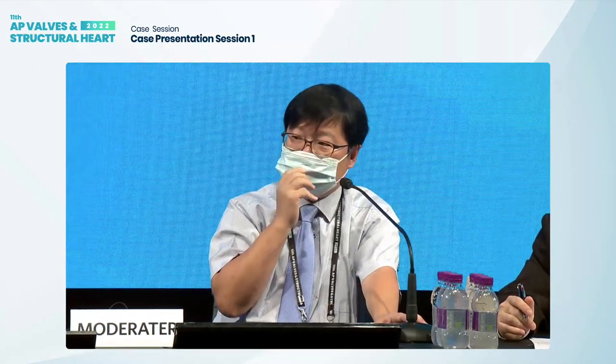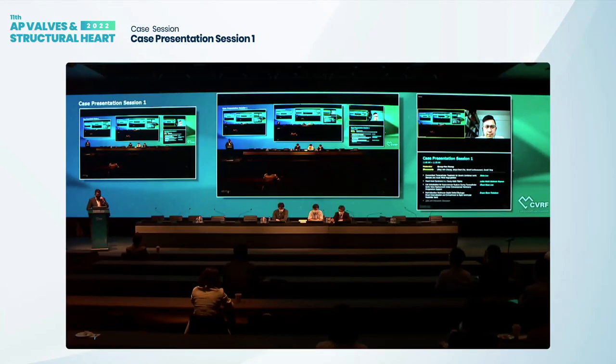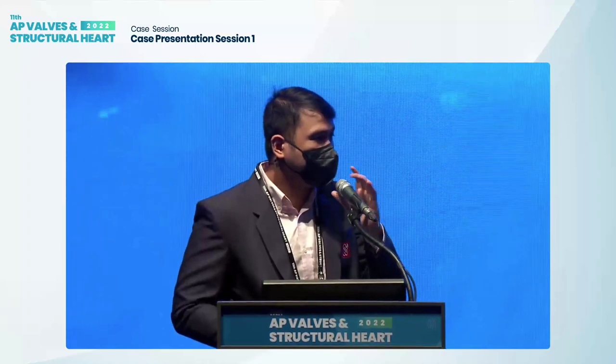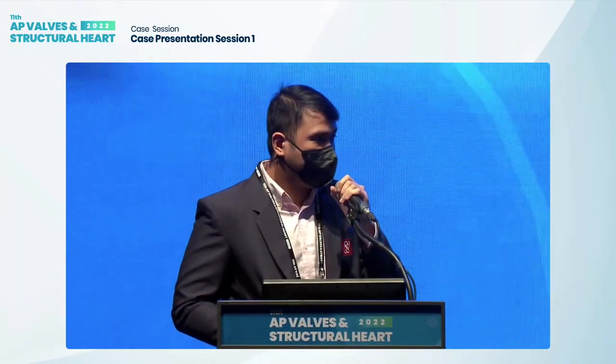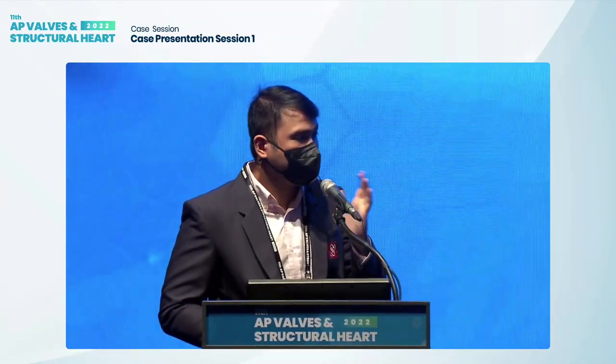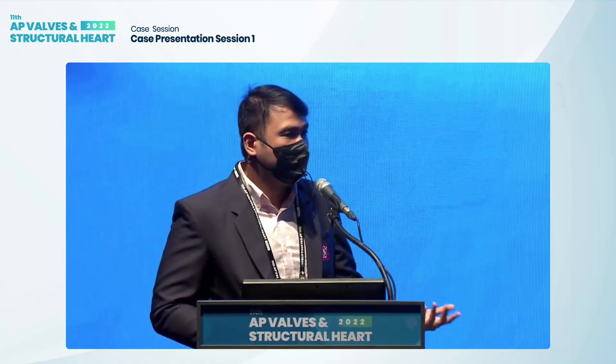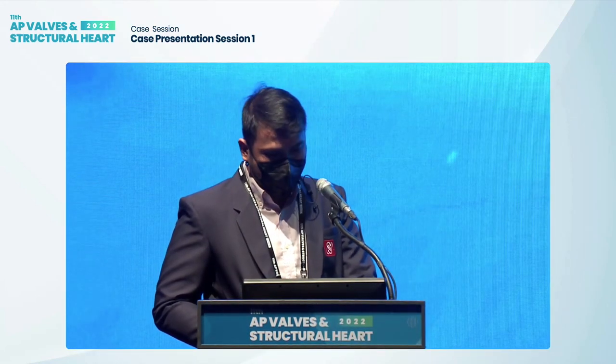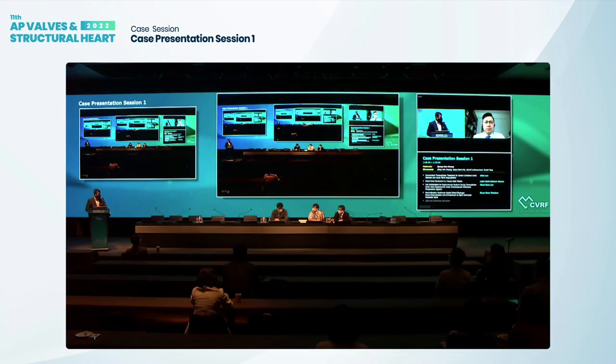Because seeing the LVgram can be a very good point if the procedure was done right or not. Yes, doctor, that's right. But we opted not to do an LVgram because the kidney function of the patient is low and it's deteriorating. So that's why we chose not to do it, and we just let the 2D echo guide us. Thank you.